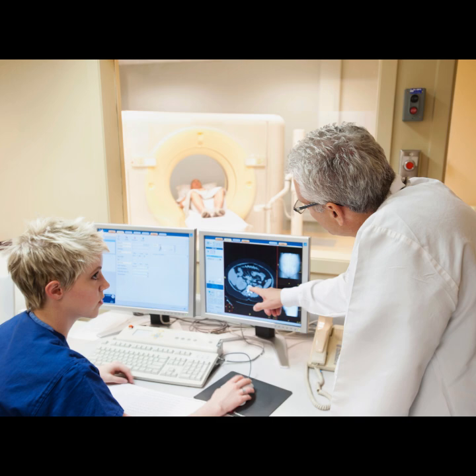This exponential noise amplification inevitably, I would argue, degrades the signal-to-noise ratio, potentially to clinically unacceptable levels, making the images unusable long before the actual R2 signal has truly vanished. We need robust methods for clinical diagnosis, not. That's a fair assessment of the signal-to-noise trade-off. I'll concede that, but it must be optimized against the specific image application we're talking about.